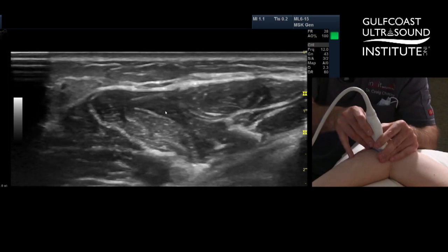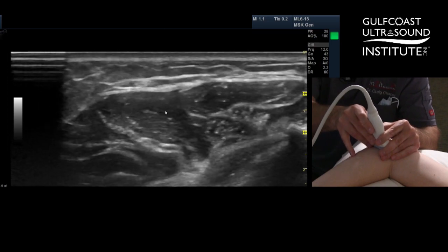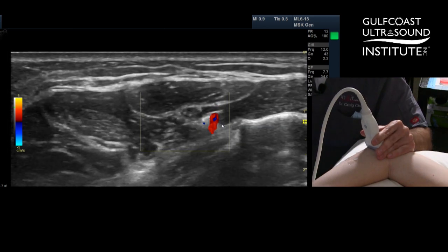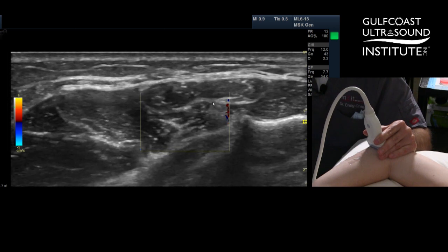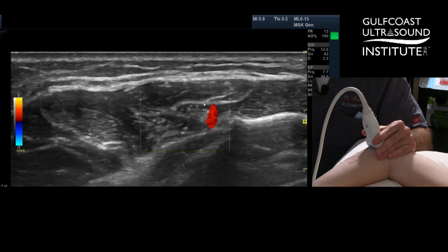And there's a little artery that travels by it. I'm just making sure it's kind of the bottom right hand of it, so that it doesn't interfere with our injection or the plane we're going to be in. So here's the artery right here. If we go distally, we see that it leaves that plane of the flexor carpi ulnaris. I'm going to come in the flexor carpi ulnaris plane above the artery. So that's it. I'm going to come above it right here.